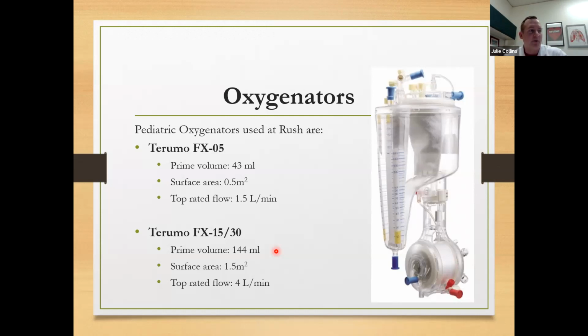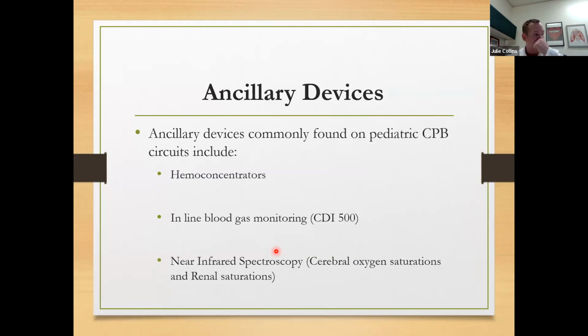So if it's a relatively quick case, sometimes you can push the envelope more and get away with it. If I know I'm going to be on pump a long time and we're cooling down more than typical, I will use the larger oxygenator.